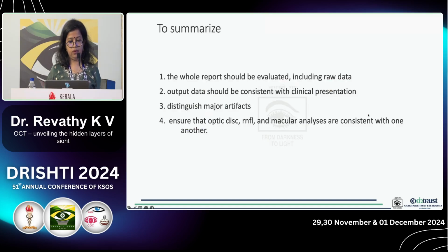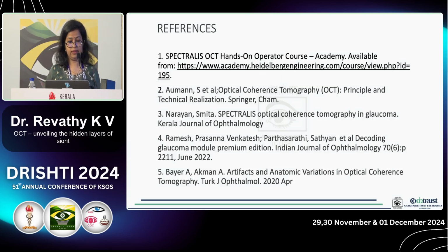To summarize, the whole report should be evaluated including the raw data. Output data should be consistent with the clinical presentation. Distinguish the major artifacts. Ensure the optic disc, RNFL and macular analysis are consistent with each other. Thank you.